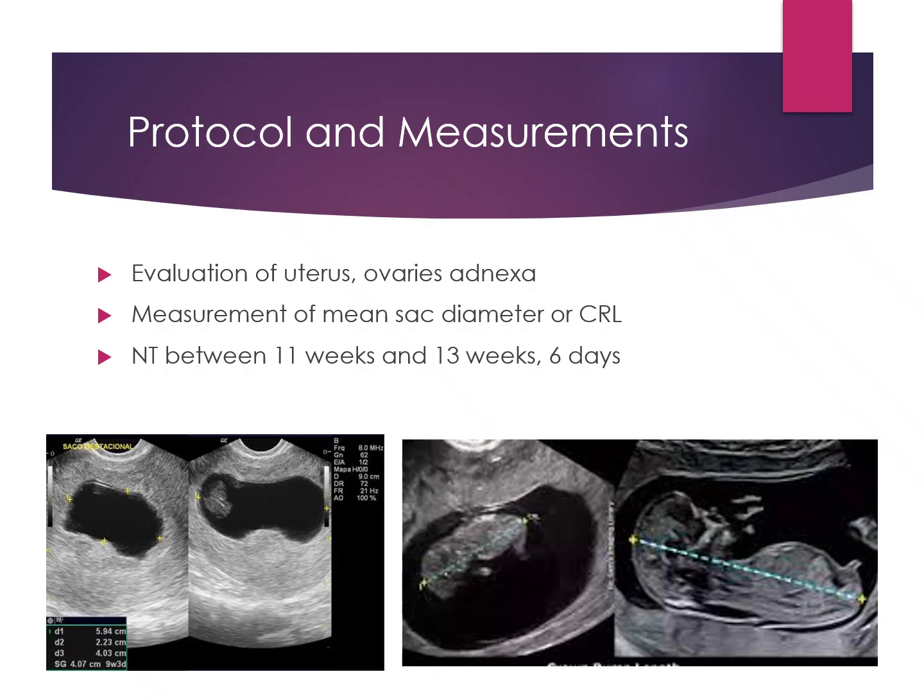And in that time, I am assessing the uterus. I'm doing the adnexa, the ovaries, just to make sure that we don't have anything else outside of there. And we're going to talk about some cases where you may have something outside of there. So it's super vital that we're taking time to assess mom as well as baby. Then we can get into the fun stuff and we can start looking at baby.